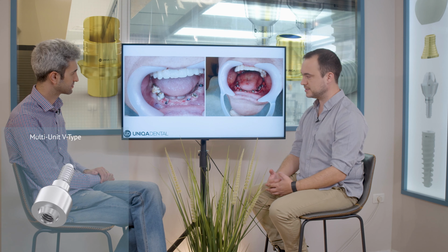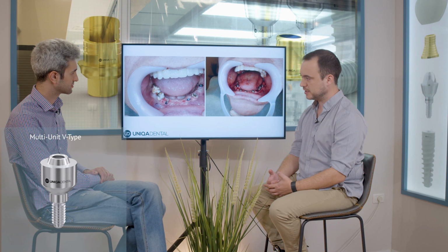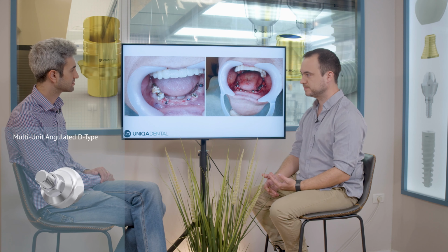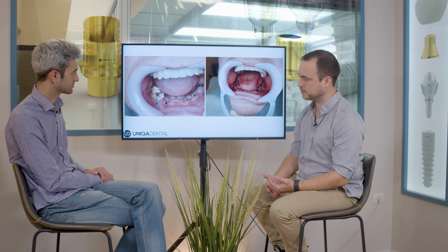Now, we placed the implants on the mandible in 2 steps. The first step, we took off the bridge, and we placed about 5 implants.